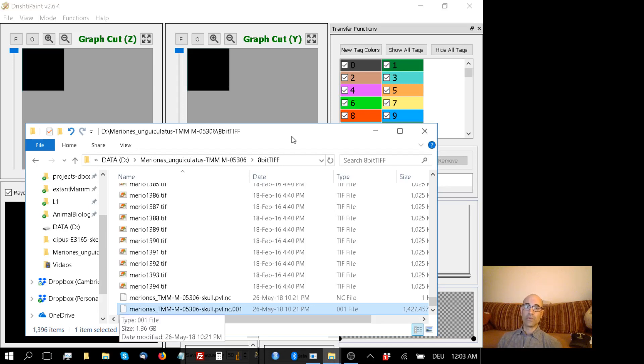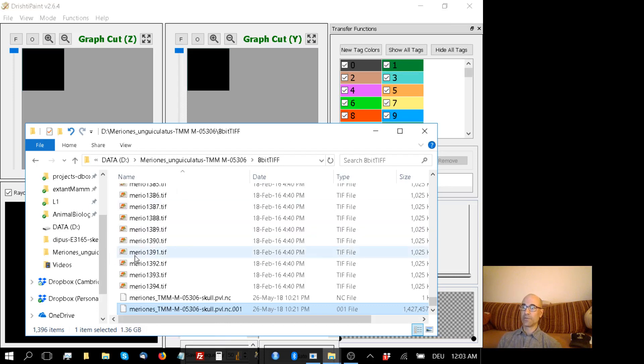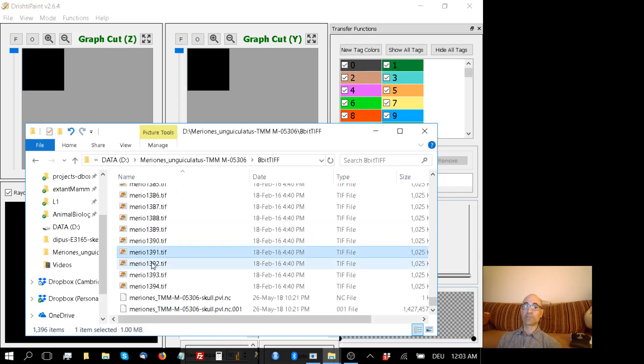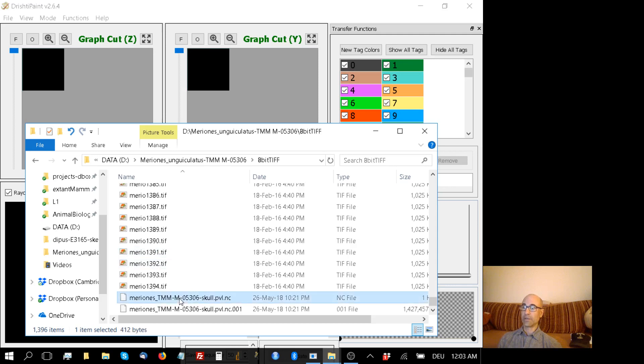Last video, we used Drishti Import to convert a stack of two-dimensional TIFF images into a volumetric file that Drishti can understand. And here they are.